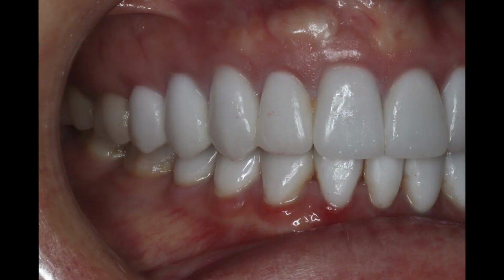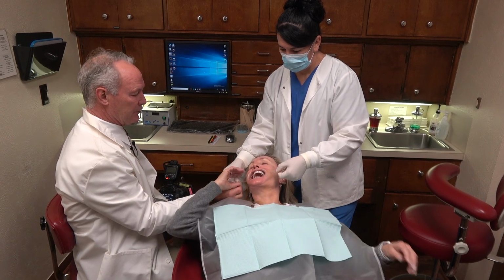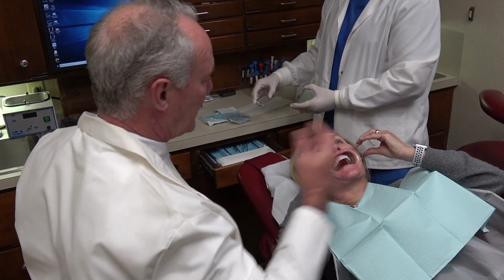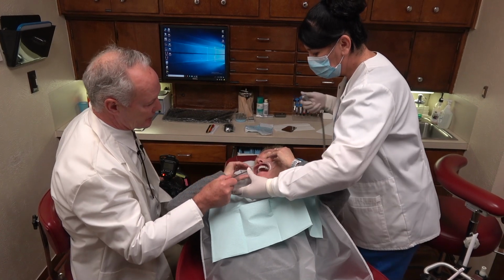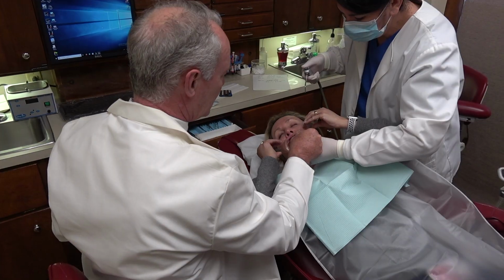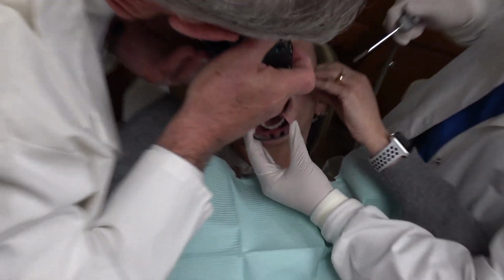Okay. Now Sharon, would you reach up here and hold these, please? I want to hold these retractors up and out as far as you can, kind of between your eyes and your ears. And turn my way, please. Okay, the small. And blow a little air on this occlusal surface, please. You want to blow some air on the occlusal surfaces of the teeth. Open real wide. Got some nice dental work done there.